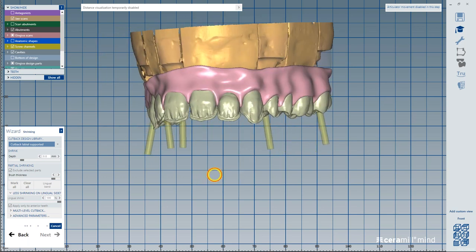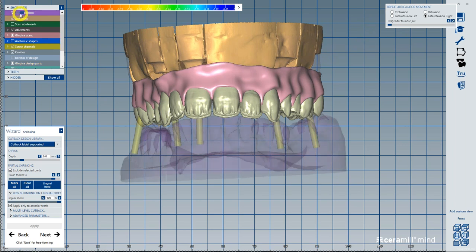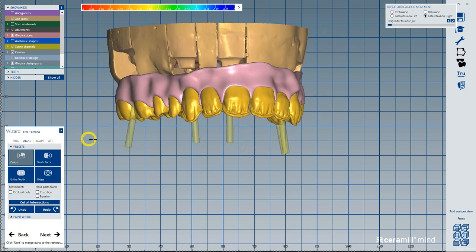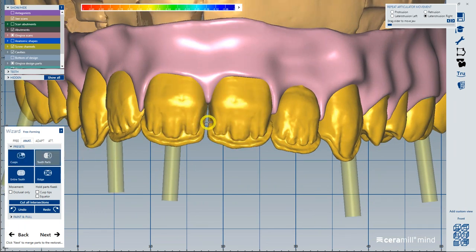At that point, while it's merging, I'm looking around and seeing if there are any adjustments I need to make or if I want to pick a different library. We can bring our antagonist back in. I can go through my movements just to check everything. So even here, we get another chance to make any adjustments. For example, if I wanted to close this up, I can grab that, close that up a little bit. Let's go next.